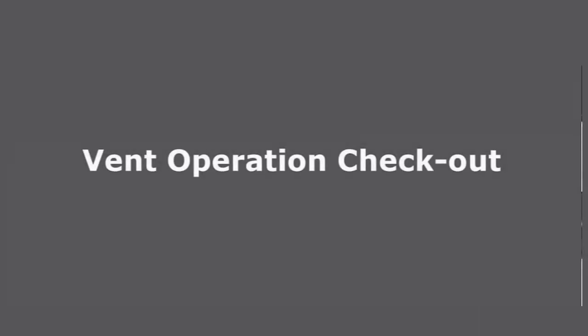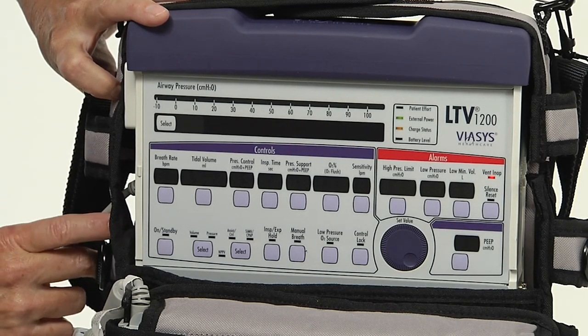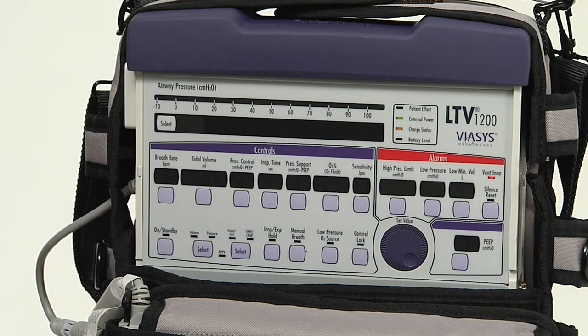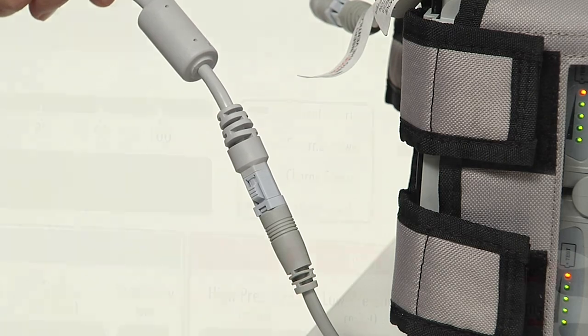Perform the vent check prior to using the LTV 1200 on a patient. Be sure you start with the ventilator turned off. Ensure that the AC adapter is connected to a valid AC power source.